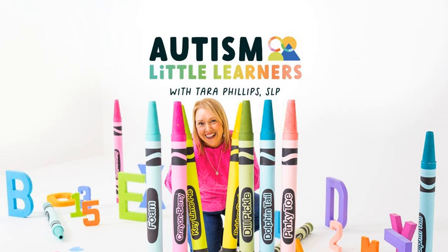Pick one daily routine this week, arrival, snack, or play, and model just 2 words on the child's AAC system. Notice how even small changes can open the door to big communication moments. Every modeled word builds connection. Every shared moment tells a child, your voice matters here.